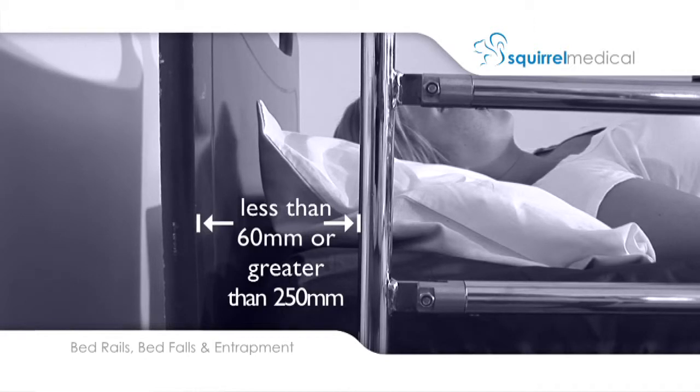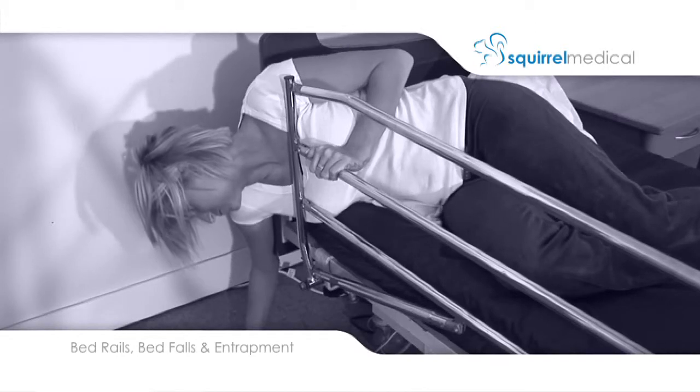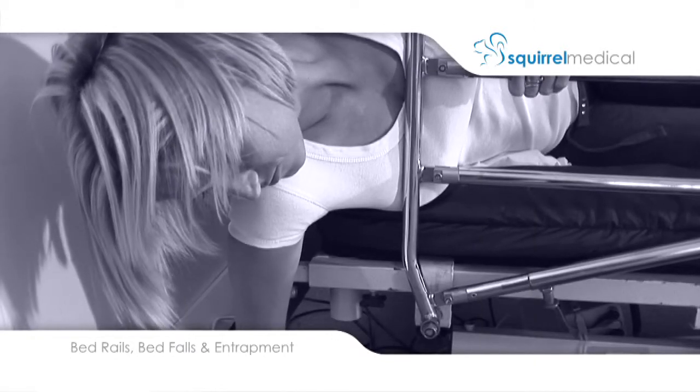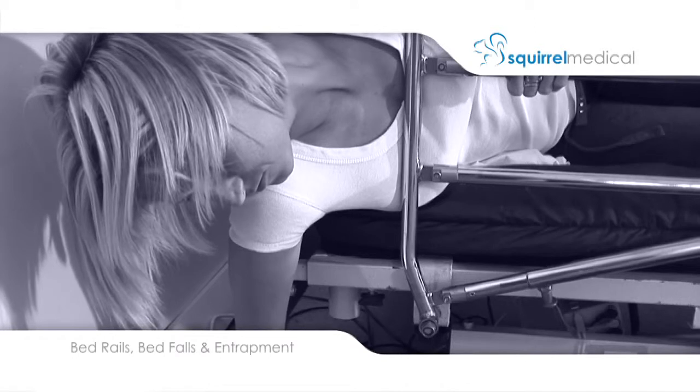The second critical measurement is that which advises a gap of less than 60 millimeters or greater than 250 millimeters between the headboard and bed rail, or footboard and bed rail. The rails of Julie's bed have been inspected and the gap is correct, being less than 60 millimeters. However, these rails are not the original ones supplied, don't fit properly, and are poorly maintained. Within a matter of hours, they loosen to expose a dangerous wedge-shaped gap, which tightens as she struggles. This is called entrapment and often leads to multiple injuries, sometimes asphyxiation and sometimes heart attack induced by shock.